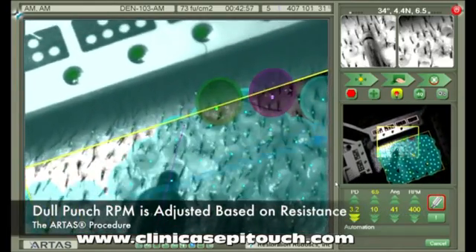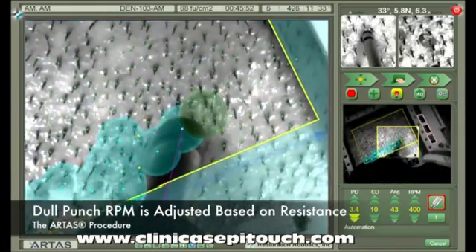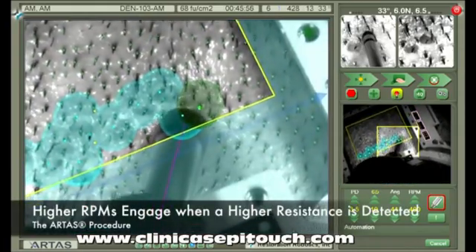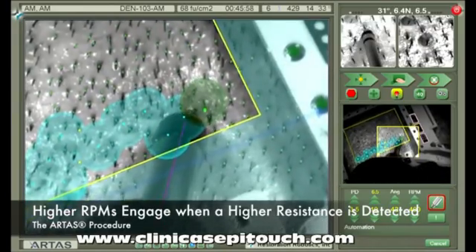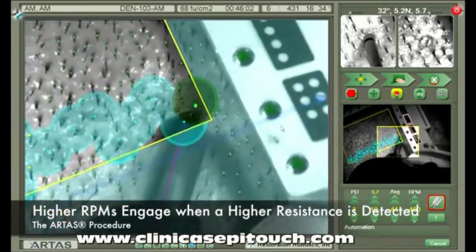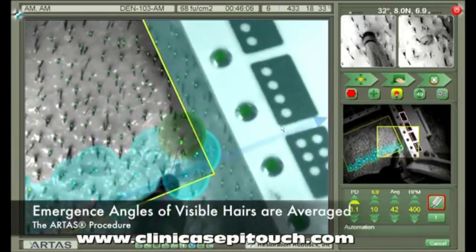Next, let's talk about RPM. RPM is the rotational speed of the dull dissection punch. Each time the dull dissection punch enters the skin, the force required to do so is measured. If a higher resistance is detected, then higher RPMs will engage automatically.